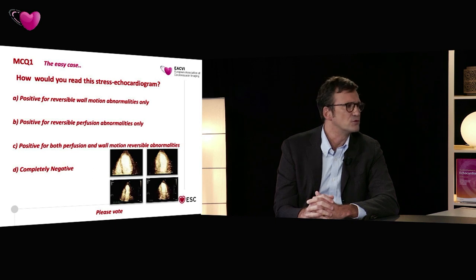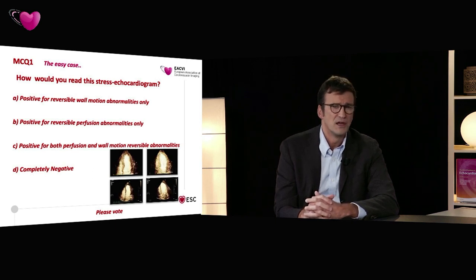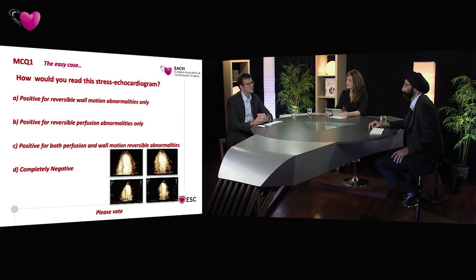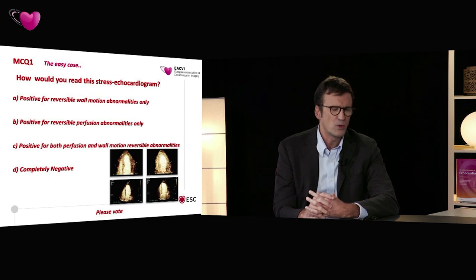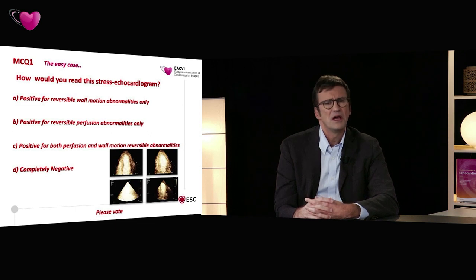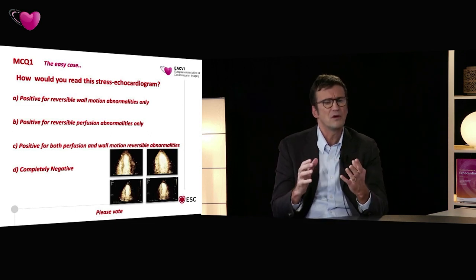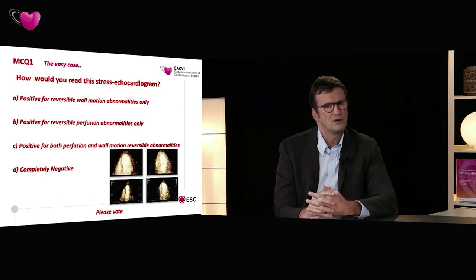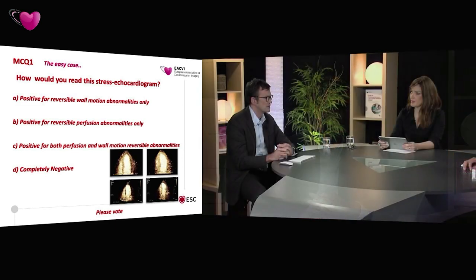There are 2 ways to infuse contrast. For perfusion, the pump and the continuous infusion is probably the best way to do it for technical reasons. But for example, the cases you're seeing here are done with bolus of contrast, 0.5 milliliter SonoVue in this case. The time you have to image is quite long for wall motion, but not for perfusion. So you have to be quite experienced in getting perfusion from your images using bolus. When you start learning contrast, it's much better to use the pump.